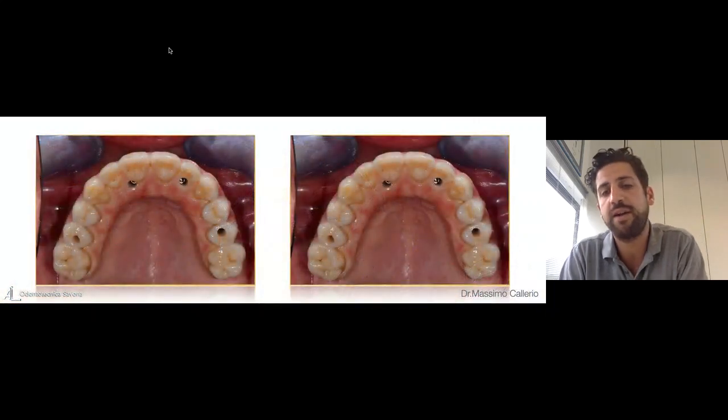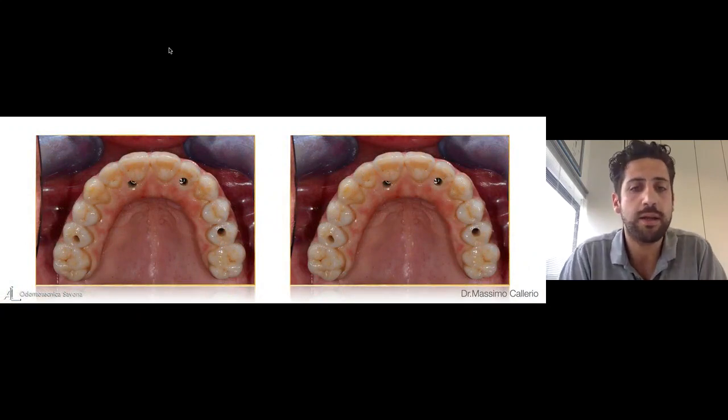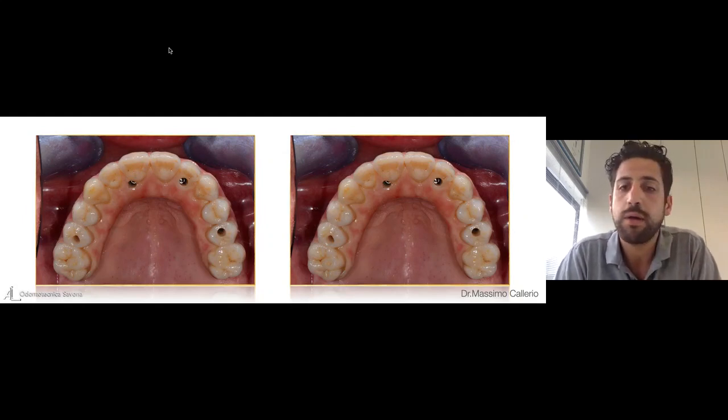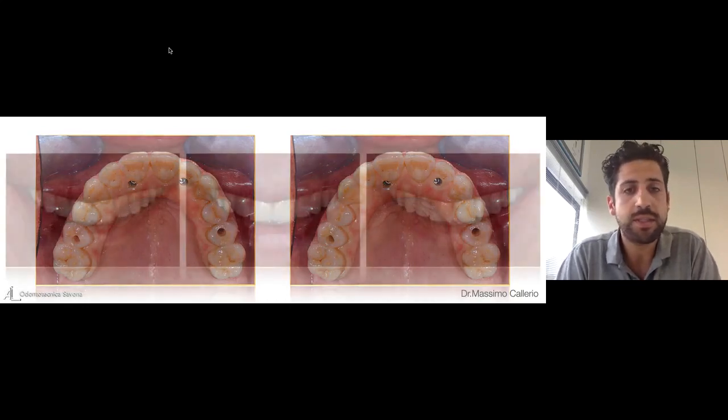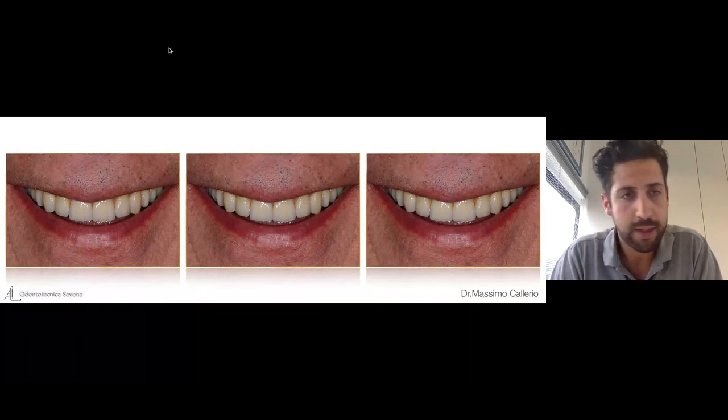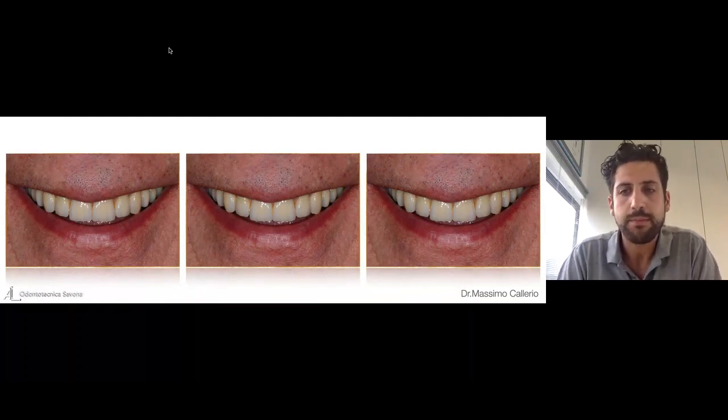Okay, and this is the final case mounted in the mouth of the patient. This case was made with Dr. Massimo Callerio from Milan. We are really thankful to him. This is the occlusal surface, and this is the final case with the smile of the patient. All in full contour zirconia.